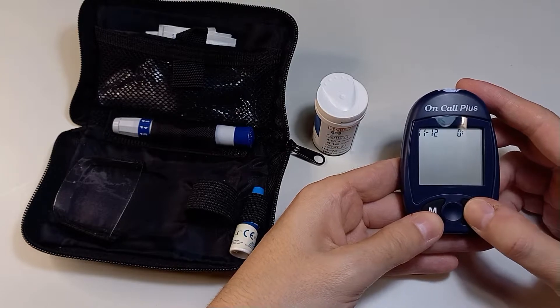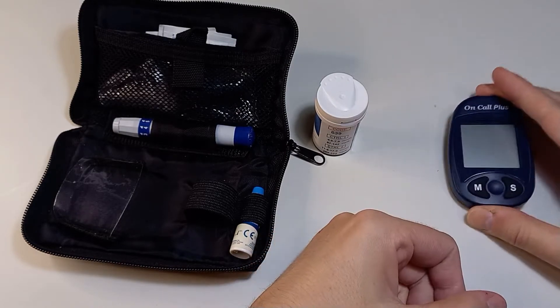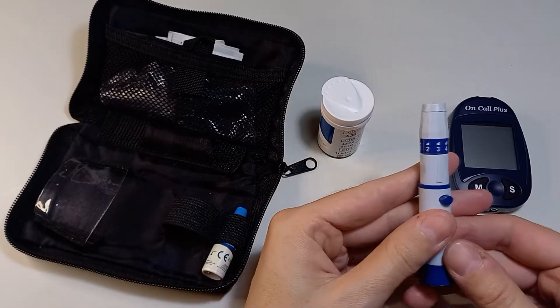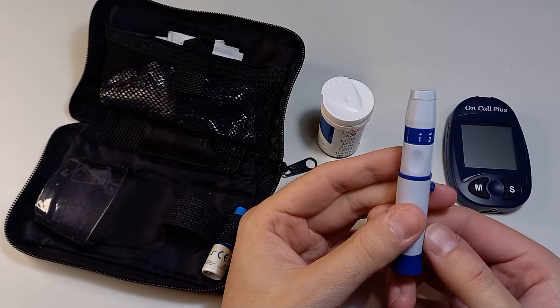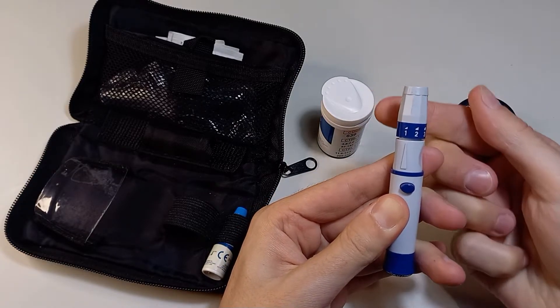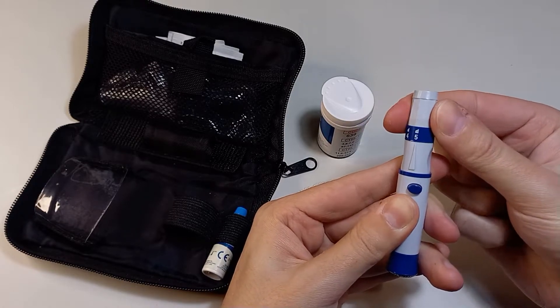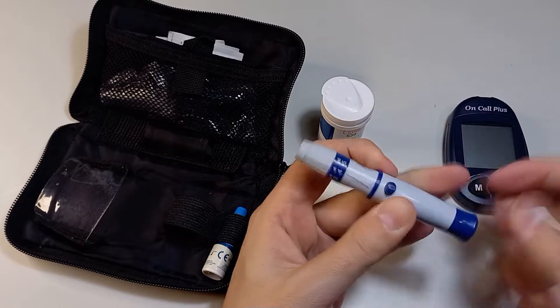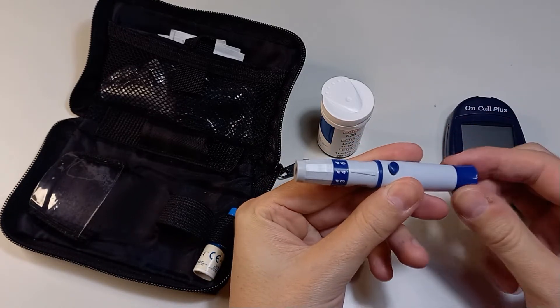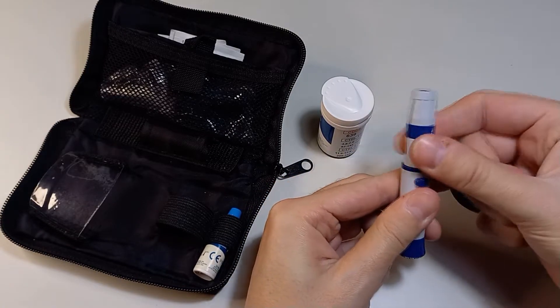That is the spring-loaded adjustable lancet. You have to select the desired needle depth according to how soft your skin is. To load it you have to pull the back part until you hear a click, then when you press the button it will be triggered.